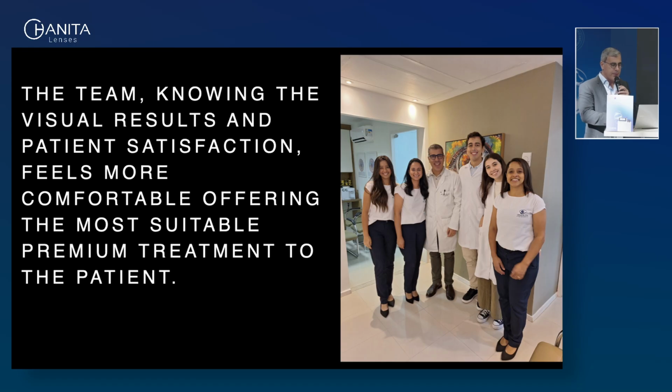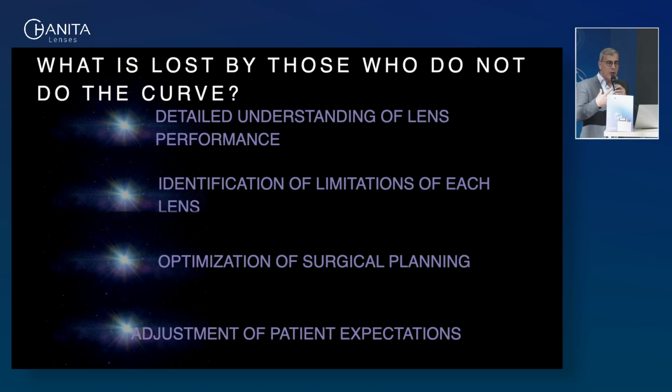What I think is lost by those surgeons who do not perform the curve is the understanding of the lens performance, because one thing is the ideal IOL performance for the ideal patient in a scientific study. The other thing is how it really works in our clinics. You fail to identify the limitations of each lens. You fail to optimize your surgical planning, because every surgeon should optimize his results for his biometry.